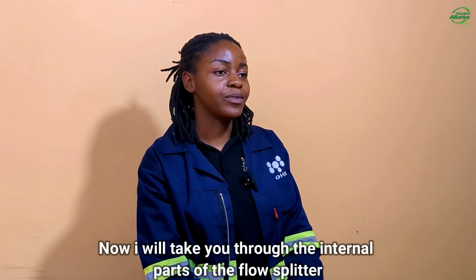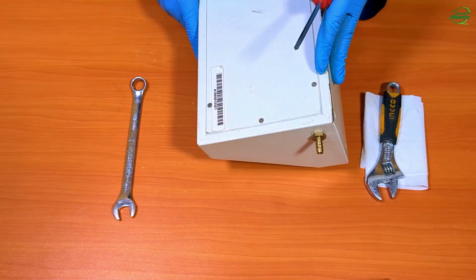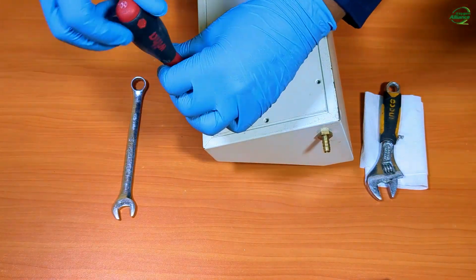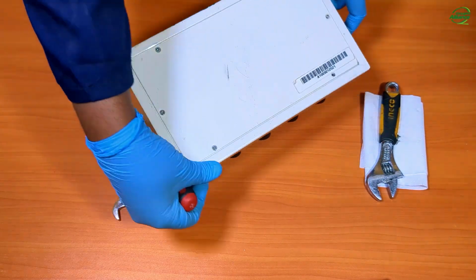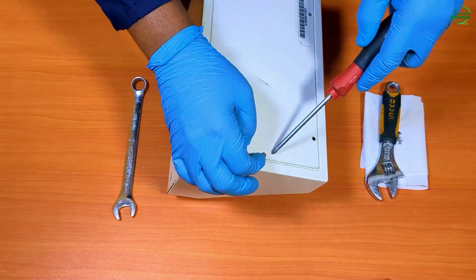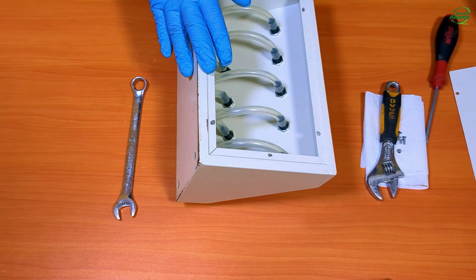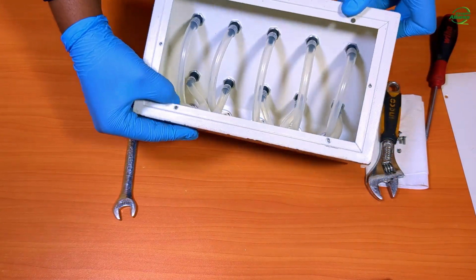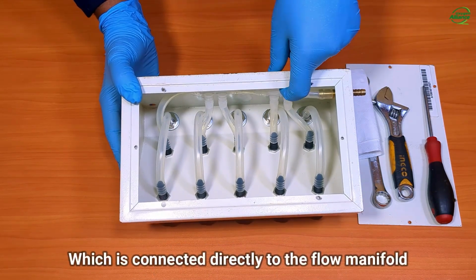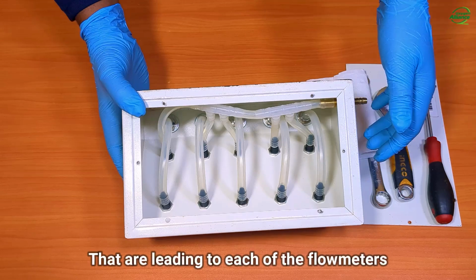Now I will take you through the internal parts of the flow splitter. And to do that, we're going to need a Phillips screwdriver. So as you can see, the flow splitter has an oxygen inlet port over here, which is connected directly to the flow manifold. So from the flow manifold, you have 5 different pipes that are leading to each of the flow meters.